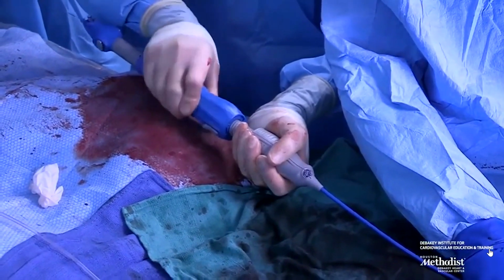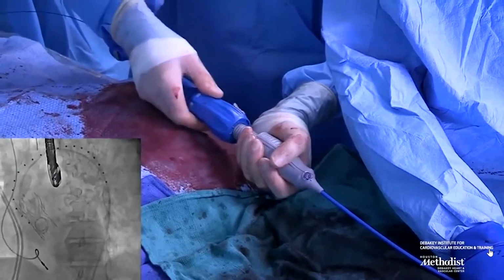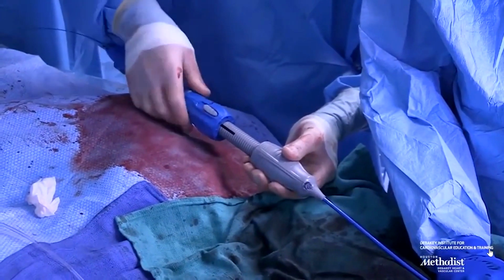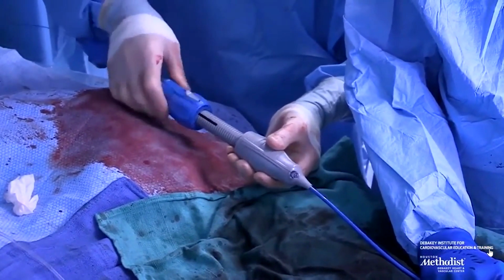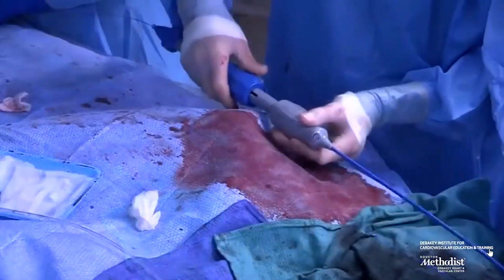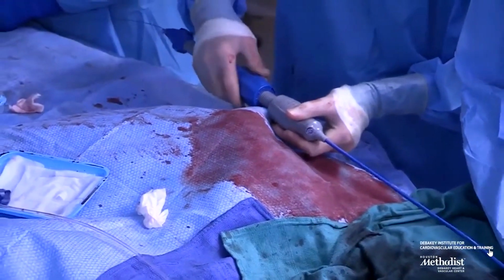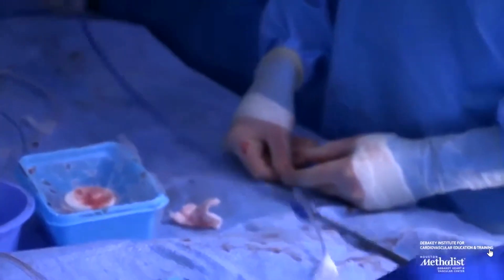Once you're two-thirds out of the way and you like the position of the valve, you shoot an image of the root. If you like it, you continue to deploy after 4 minutes to allow the nitinol frame to warm up. Once it's completely detached, which you'll see in a minute as they continue to roll, you have to put the cone back inside of the retrieving mechanism so that you don't dislodge the valve, and then you retrieve the delivery system through the valve and put it back into the descending aorta.